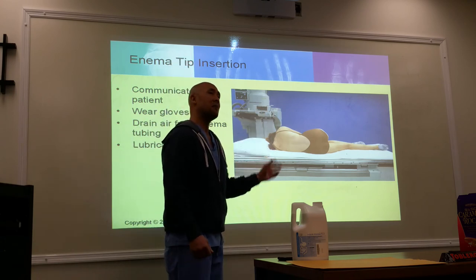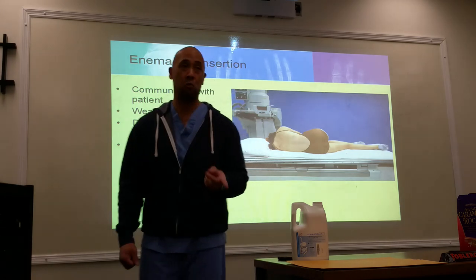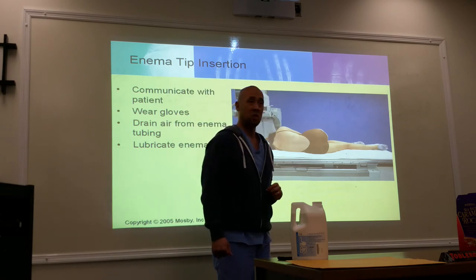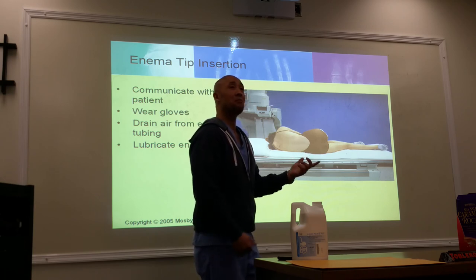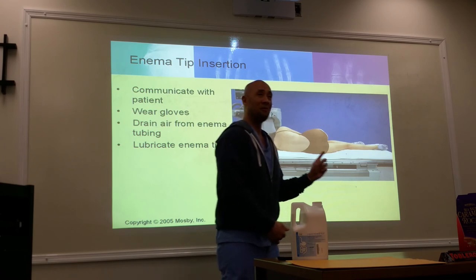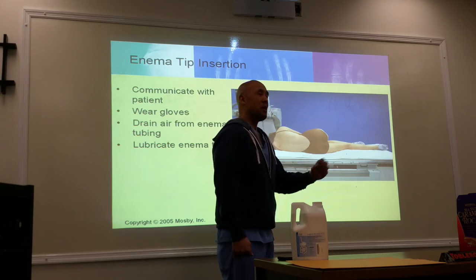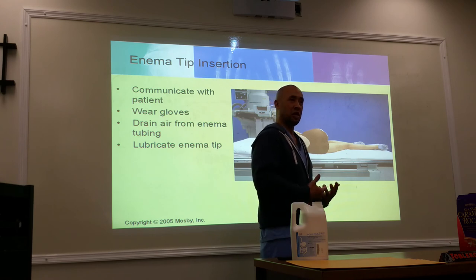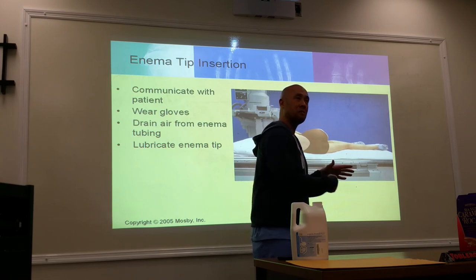So they roll over, now I'm going to say, okay, Miss Jones, I'm going to get ready to put this enema tip in you. Are you ready? What you're going to feel here in just a moment is the tip insertion. Miss Jones, I want you to take a deep breath in, blow it out, take another deep breath in, and as they're taking a deep breath in, I'm going to have them blow out one more time. What we're doing here is, when you're inhaling, you're exerting. When you're exhaling, it's relaxation. So when they exhale, that's when you slip them the tip.